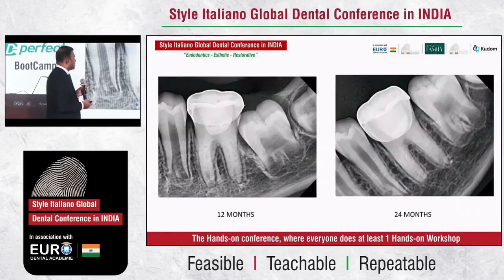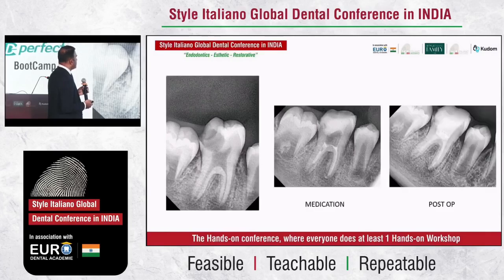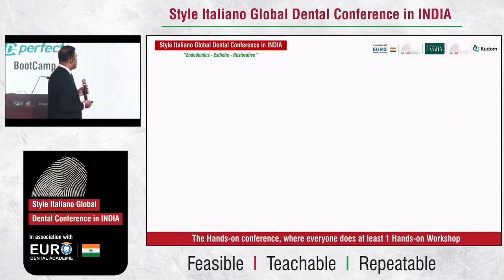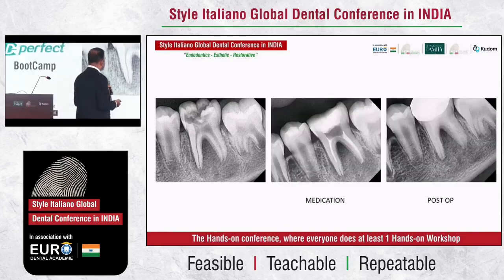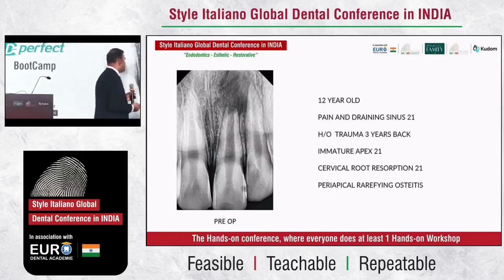This is a 2-year follow-up. Another similar case, again lower molar revitalization, 17-month follow-up. This is another case, the third case with a larger lesion. Again, 2-year follow-up with excellent healing and repair.